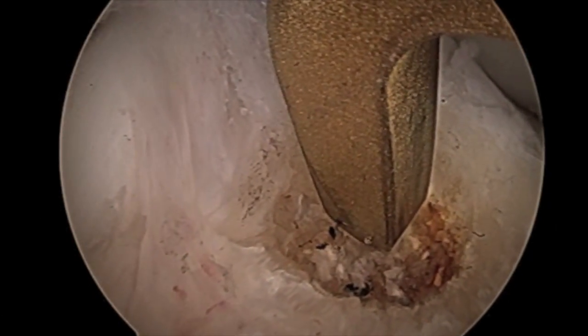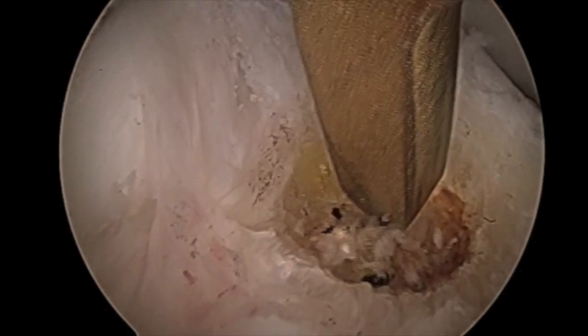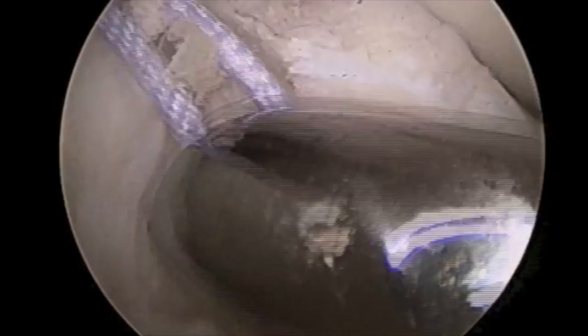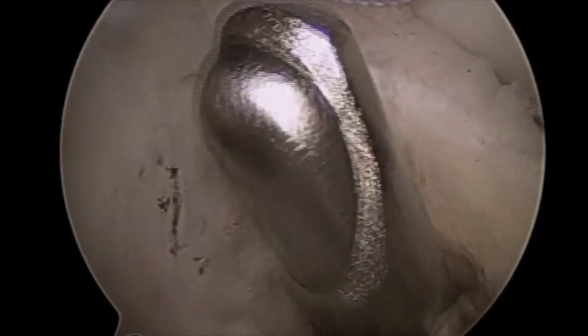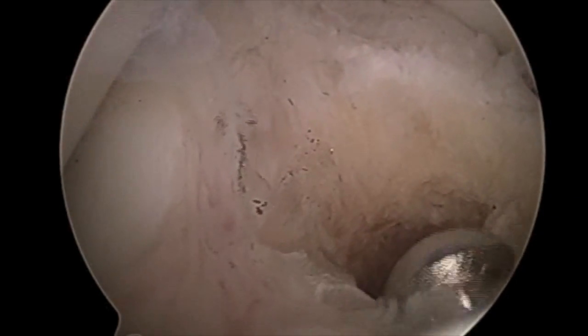A tibial tunnel guide is placed at the center of this mark and a guide pin is advanced into the joint. Over this guide pin, an appropriate sized reamer — in this patient an 8 millimeter reamer — is advanced to create the tibial tunnel. Once the tunnel has been created, an arthroscopic shaver is introduced to clear the edges of the tunnel.